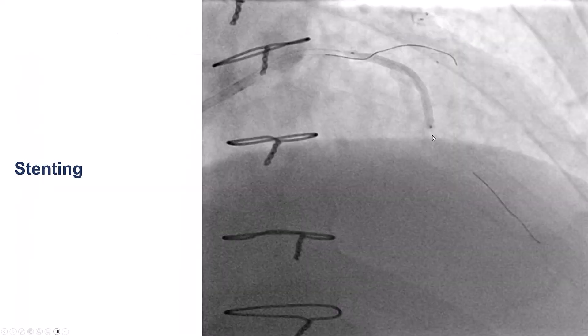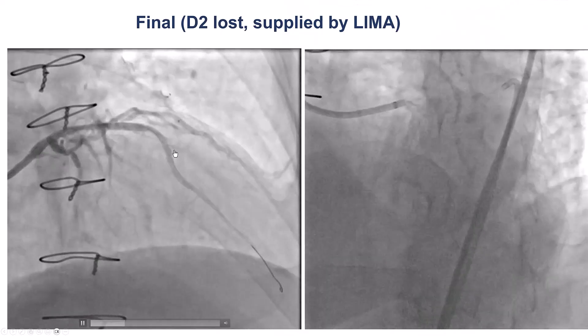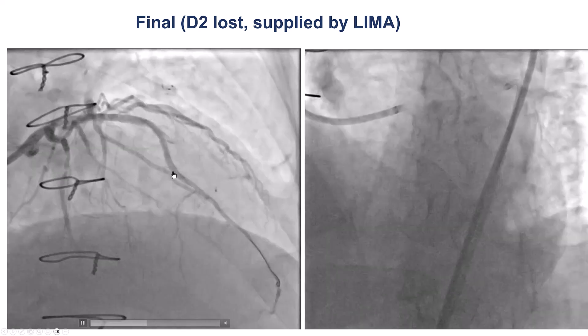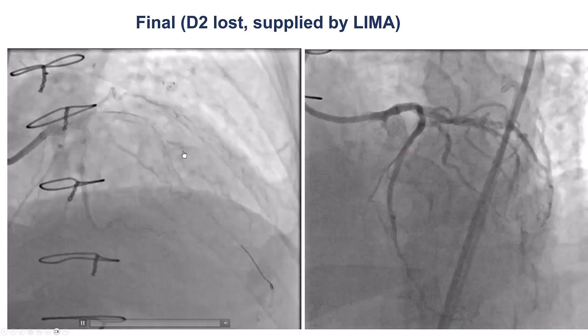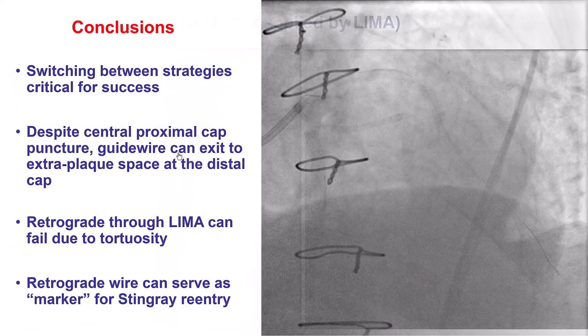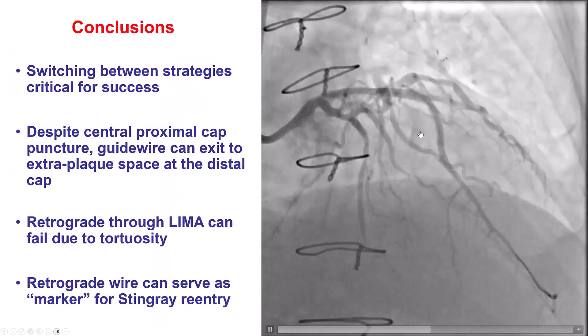The downside of this approach is that we lost the second diagonal. However, we do have the LIMA on it, so we did not mind that much. We predilated, stented, and got a nice result with TIMI 3 flow into the LAD. The second diagonal is lost but it is filling through the LIMA, so that's not a problem. And this was the final result.